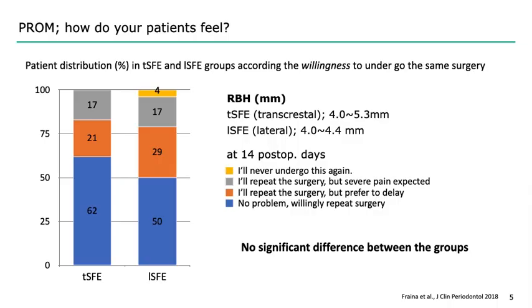From the patient point of view, there was a study investigating how the patient liked the surgery. They were asked how they liked the surgery at the 14th post-operative day. From this study published in 2018, although a handful of people went through kind of unpleasant experience, the level of patient discomfort was the same between the two surgeries. So patient discomfort would not be a determinant for the choice of approach. So there is no significant difference between the two approaches to the maxillary sinus.